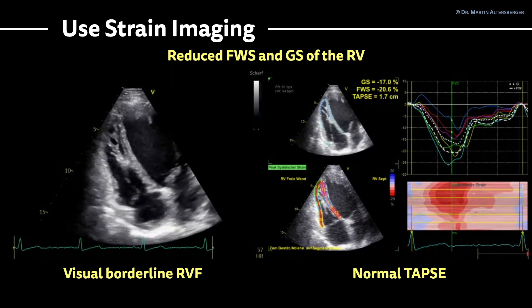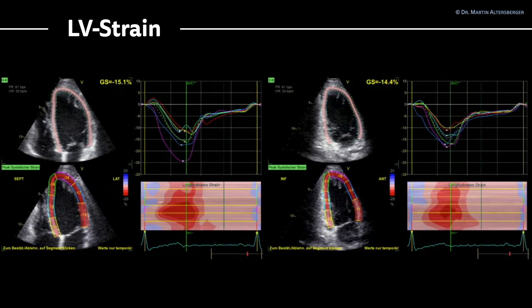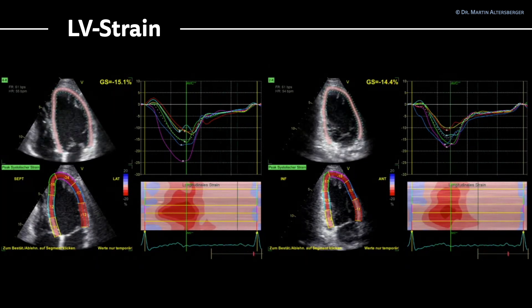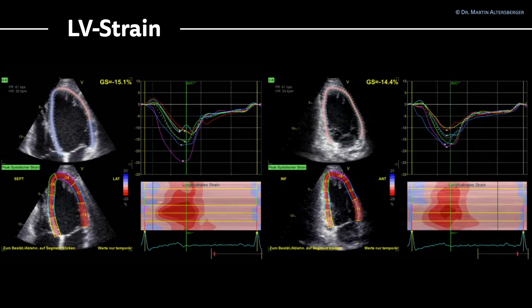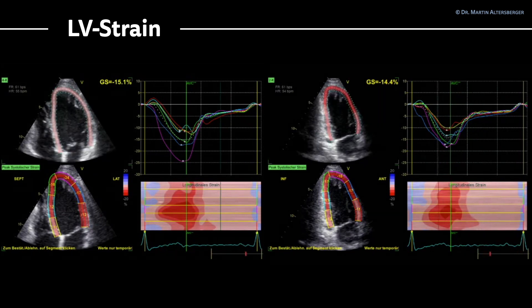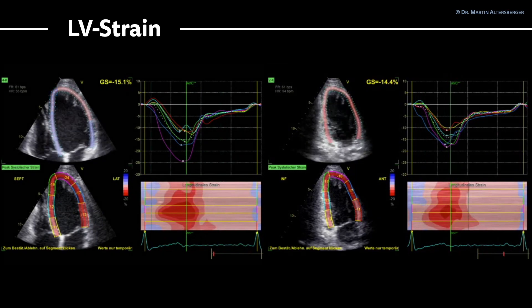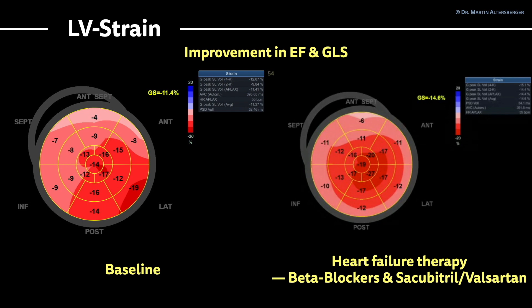For left ventricular strain, the follow-up exam shows the global strain in the four-chamber view is minus 15 and in the two-chamber view approximately minus 14. More areas in the strain M-mode imaging are toward dark red, implying that left ventricular longitudinal function definitely improved. This improvement was seen in both ejection fraction and global longitudinal strain.